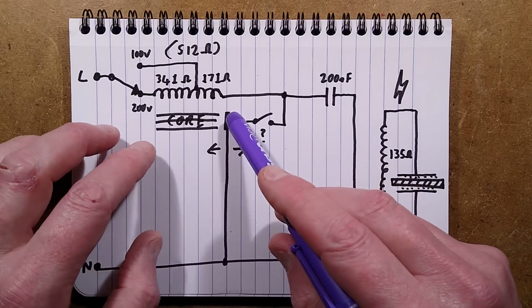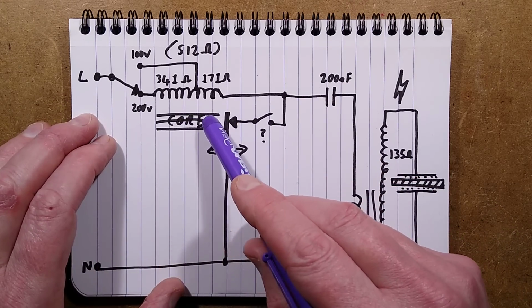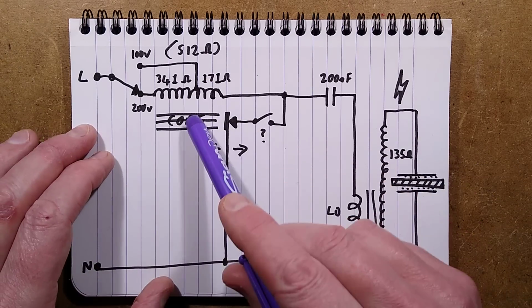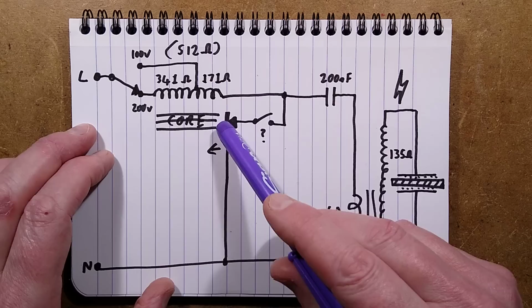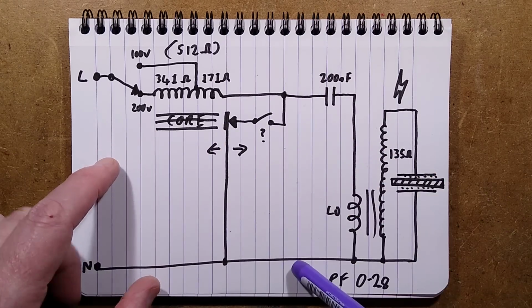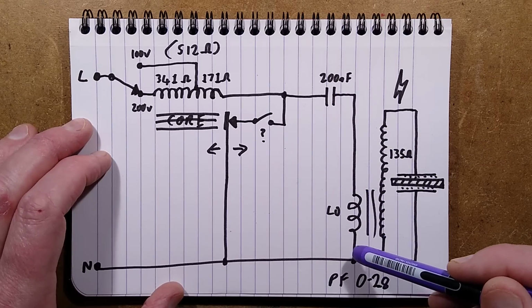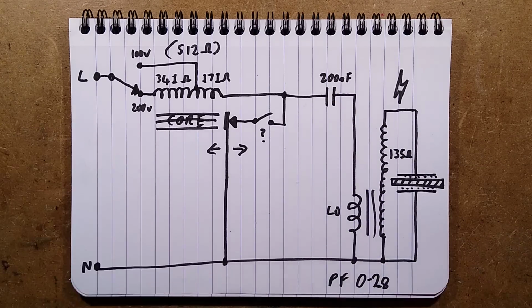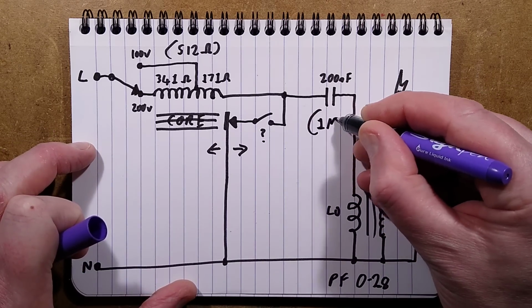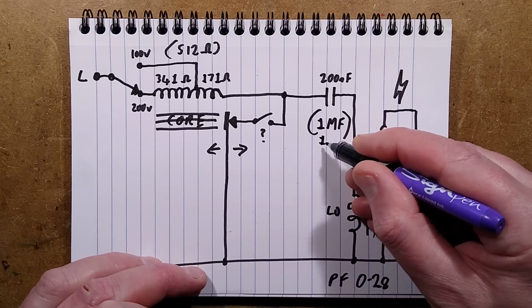When the magnetic field in this core has dropped to a low enough level, the contact closes again, and it does two things. It energizes this circuit again and starts building the magnetic field up, but also, when it closes, it shunts this capacitor down to the other side of that coil, creating a short circuit, and pulses all the energy stored in this capacitor through this primary winding, which is a very low impedance. I'll put in 1 MF, 1 kV, because that's what it was marked.